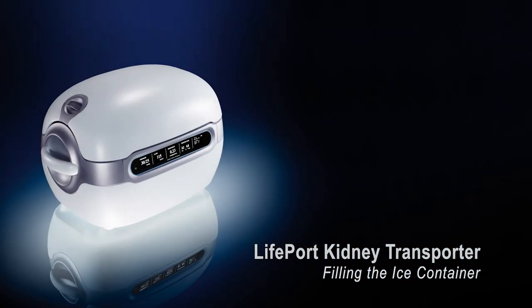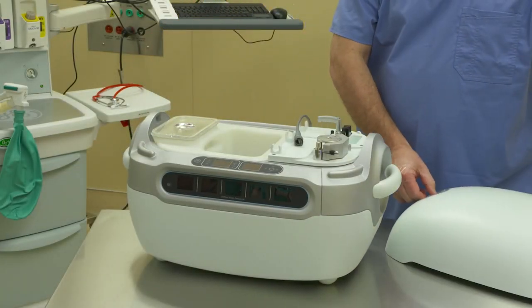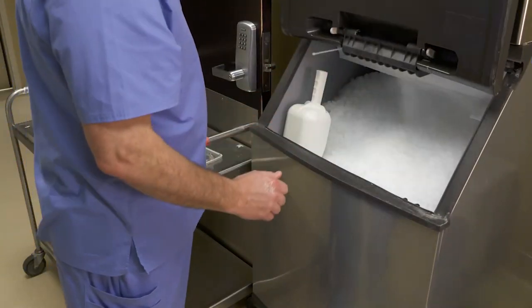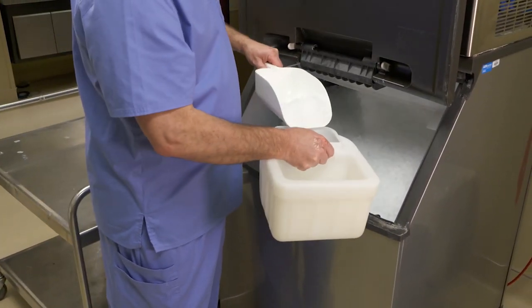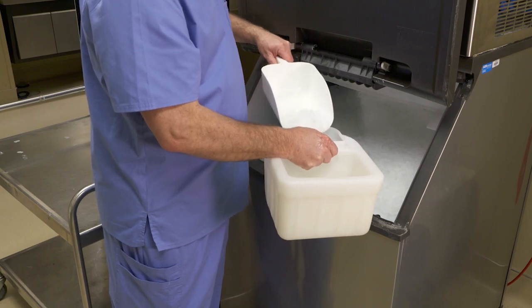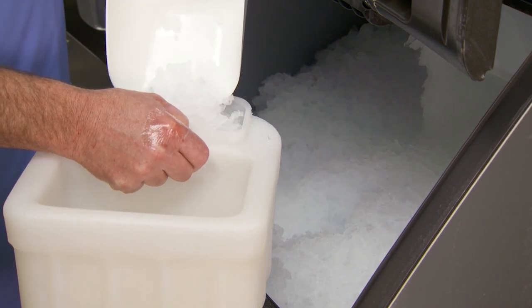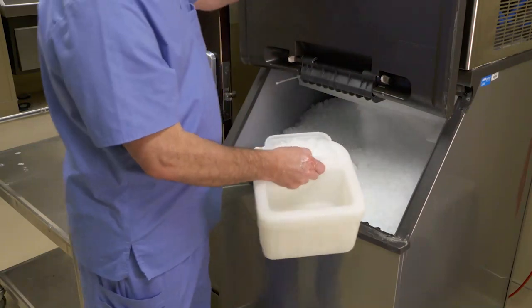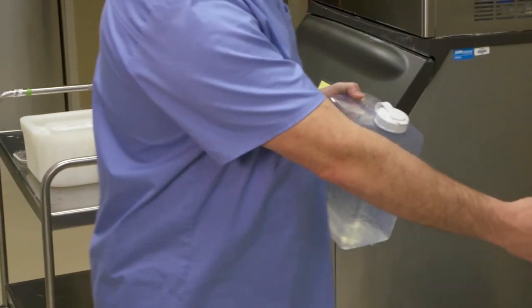Cooling down the Lifeport Kidney Transporter. To begin, remove the lid from your Lifeport Kidney Transporter. Then remove the ice container from the Lifeport. Open the ice container lid and fill the container with crushed or cubed ice. Hollow cubes are not recommended for this purpose. Push the ice as far back as possible into the ice container, maximizing the amount of ice added. Once you have added as much ice as possible, pour about one liter of cold water over the ice.